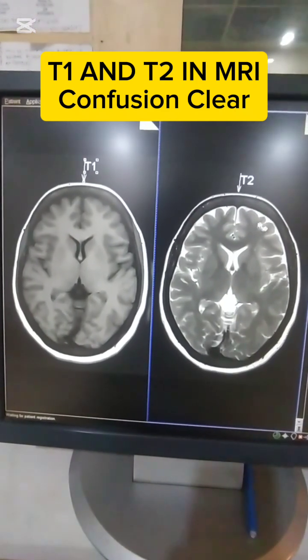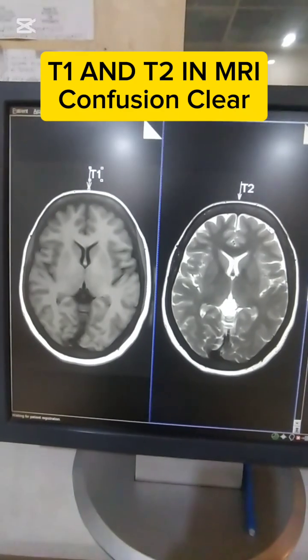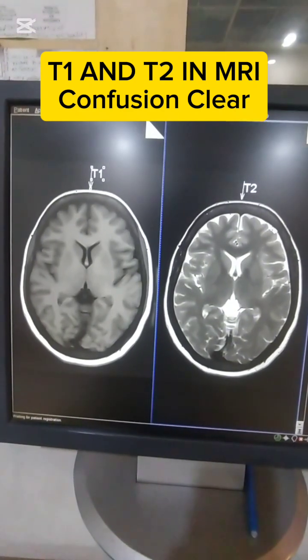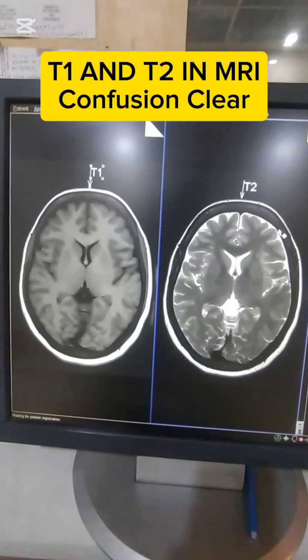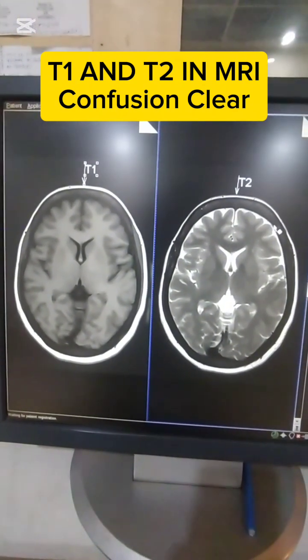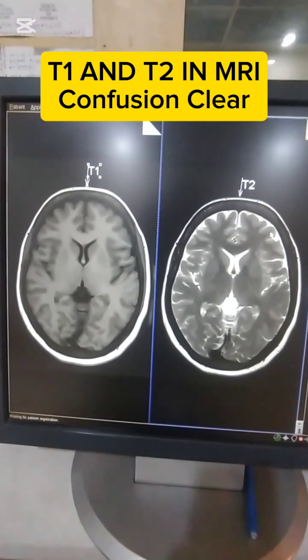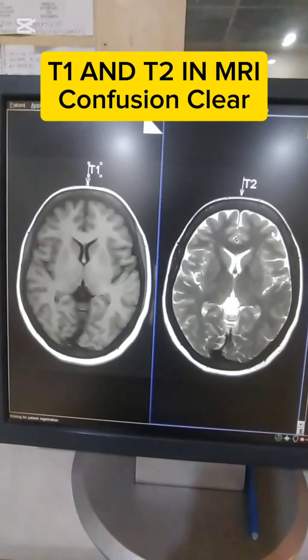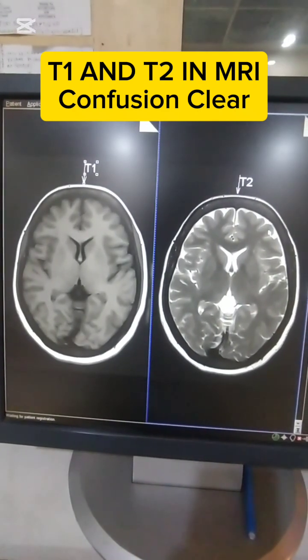T1 and T2 are technical terms used in magnetic resonance imaging to describe the time between magnetic pulses and when the image is taken. So when the radio frequency pulse is given, two relaxation processes happen simultaneously but separately at the same time.